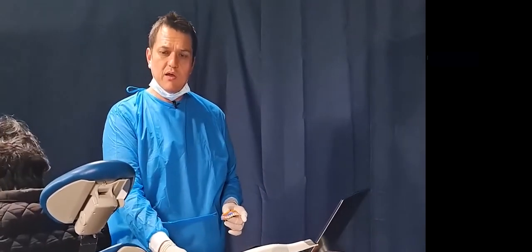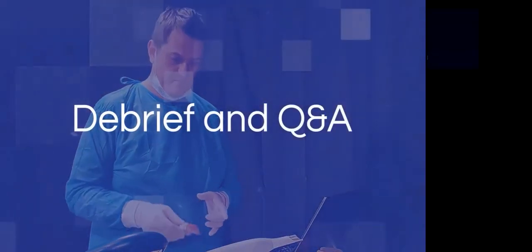In fact, I'd like this patient, if you can just, I'll put the chair down a little bit, if you can just tape aside there, I'm going to show you a couple more things that will maybe make a little bit more sense to you before we get into occlusion next time. Thank you very much for that, by the way. Perfect, and we're back. So that was amazing, and thank you so much for our patient.